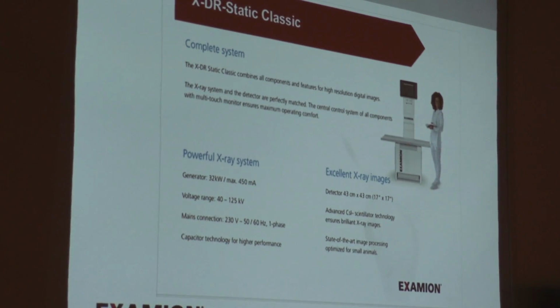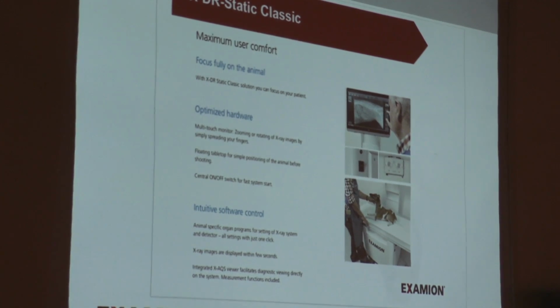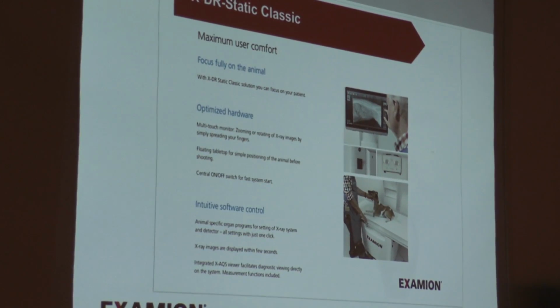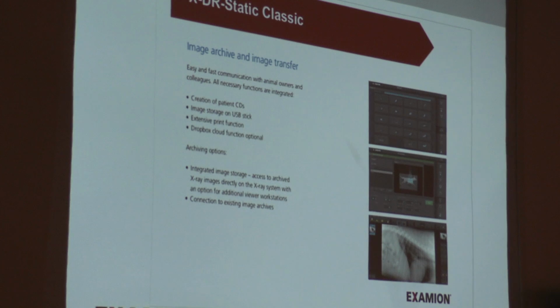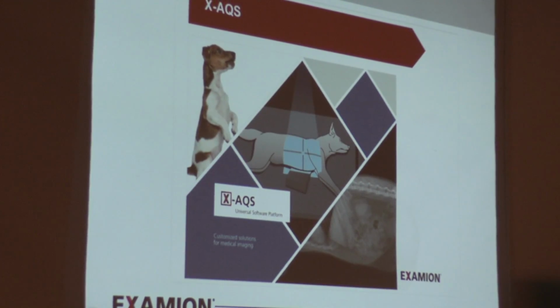It's even with the DR panel inside, so quite a large one as well. So it's quite easy to manipulate, so you can focus mainly on the animal. I'll run through that because you will see that most of these items are dealt with.